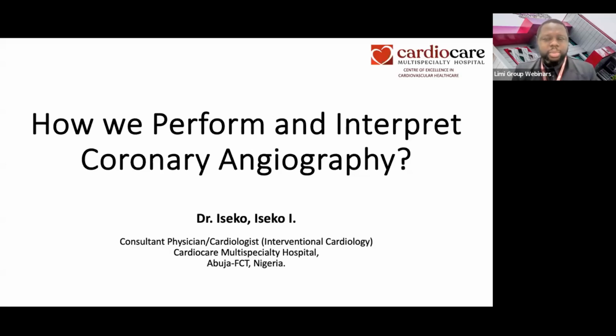Chest pain is very common. It is one of the primary symptoms of a heart attack or a myocardial infarction. And so coronary angiogram is a test slash procedure that we use in visualizing the coronary arteries around the heart, and thereby we are able to find and treat any abnormalities that could have caused the heart attack.